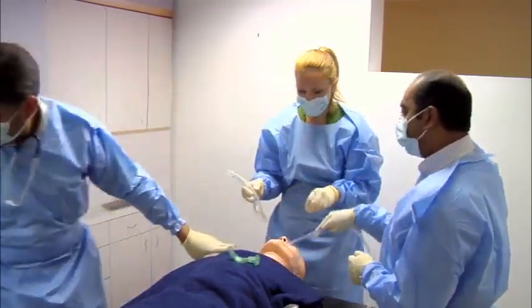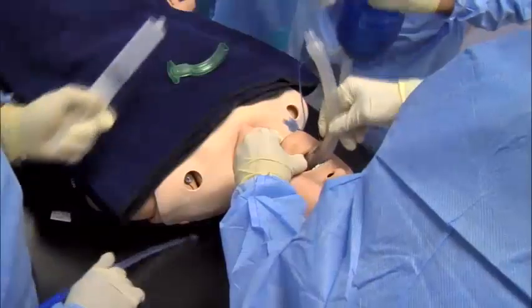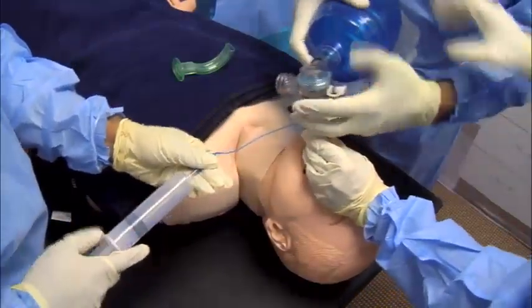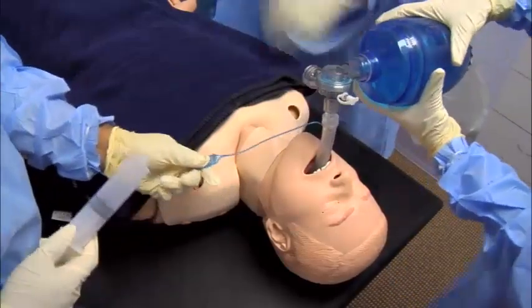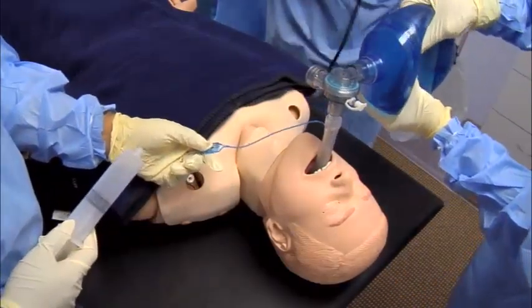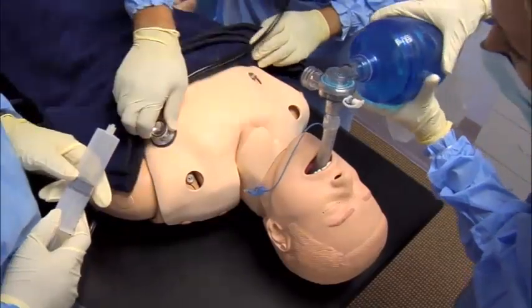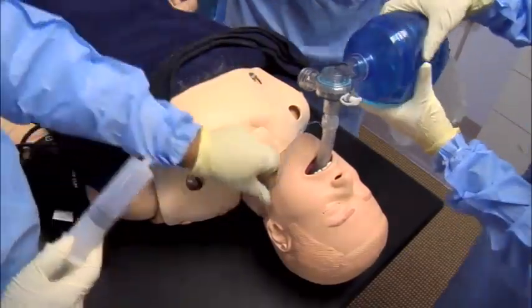Note, insertion of an LMA is not appropriate when the airway obstruction is due to a foreign body, vomiting or aspiration, or if there is airway edema. I'm not getting a chest rise and I'm hearing a leak. I'm going to reposition the LMA. Can you take the cuff down?